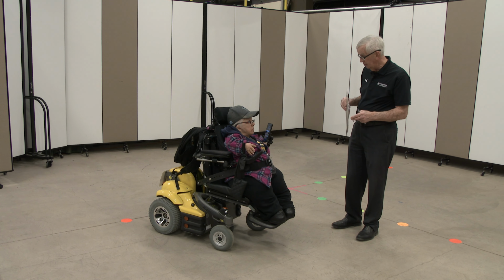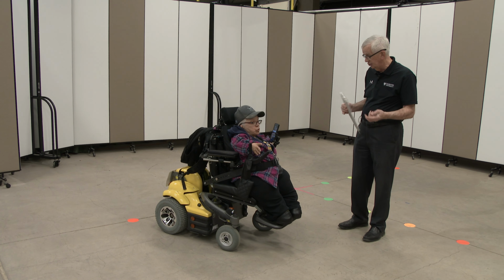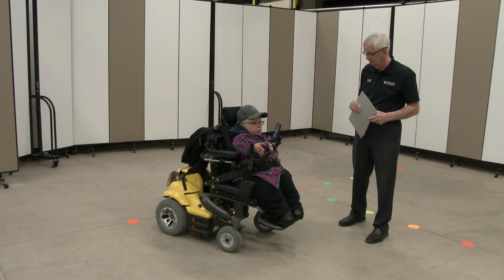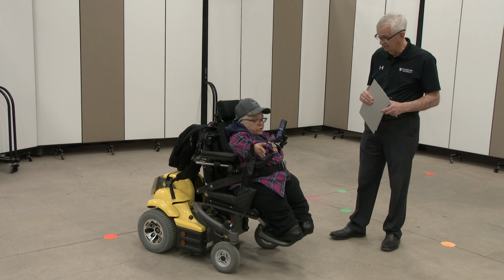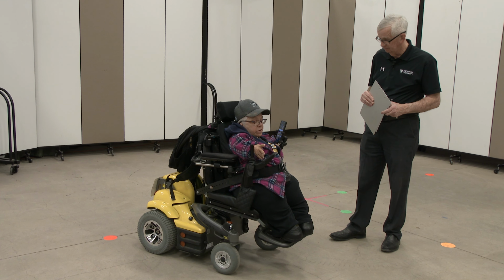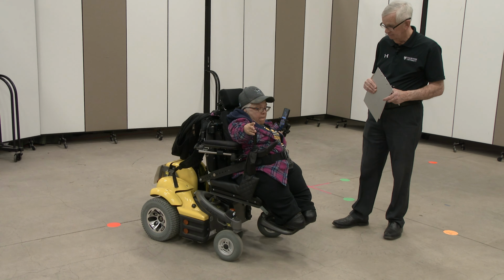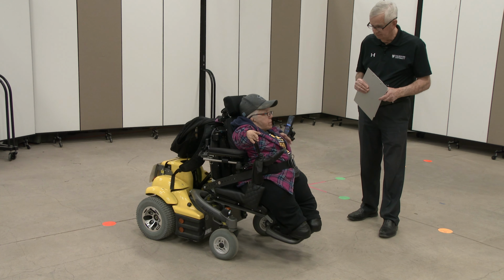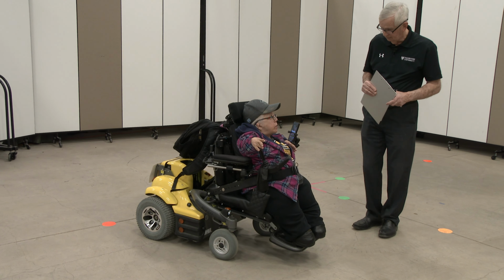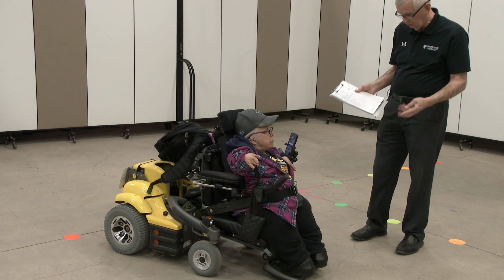So does your chair allow you to change the position of your body in different ways? Yes. Could you maybe demonstrate those for us and tell us what you use them for? Sure. I'll show you the one where I go down to the floor. The seat elevation, yes. Pardon me? It's for me to get out and start walking. Okay, so I get out and walk, perfect.